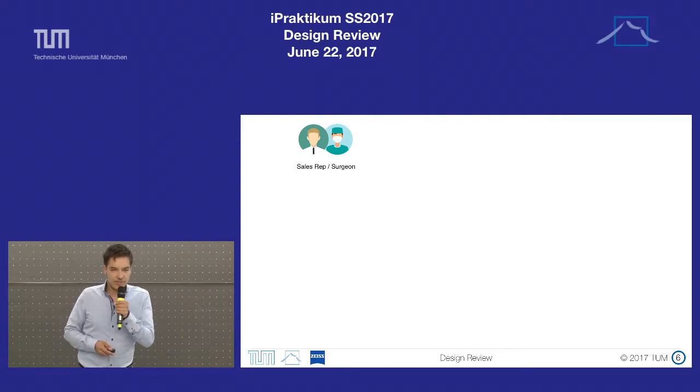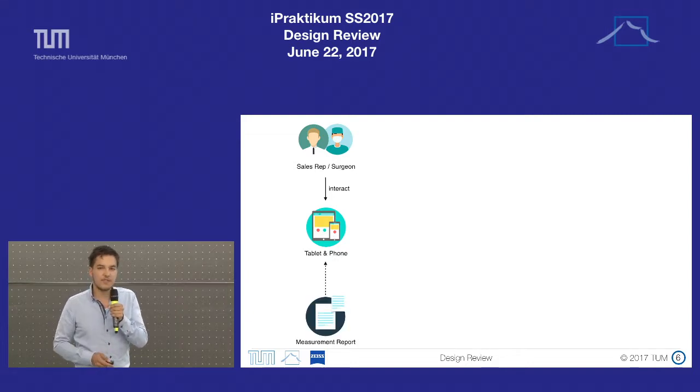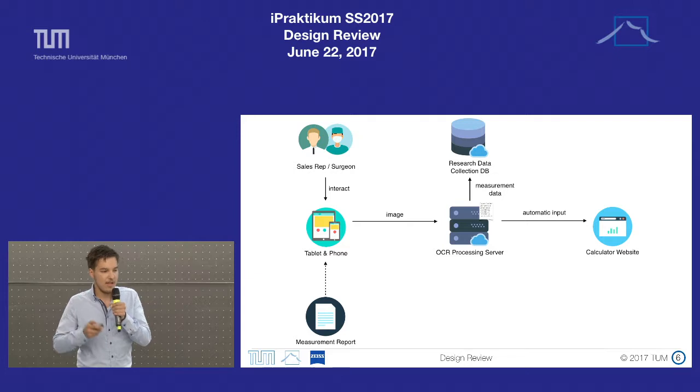We have the sales rep and the surgeon who use our app on their device. The whole process starts with them taking a picture of the measurement report. We then pre-process that report on the device and we send it to our server. And that's where the actual magic happens. That's where we use optical character recognition to extract the information from the image. Now we have usable data and we store the data for research purposes.